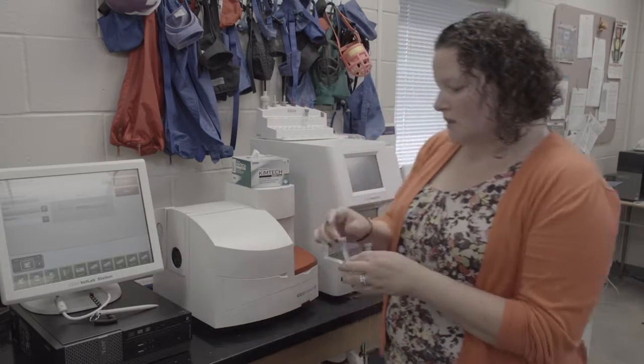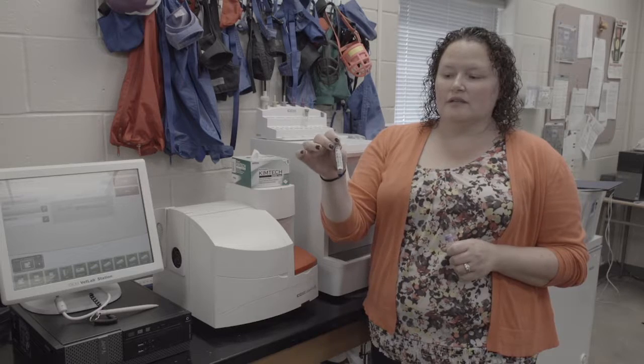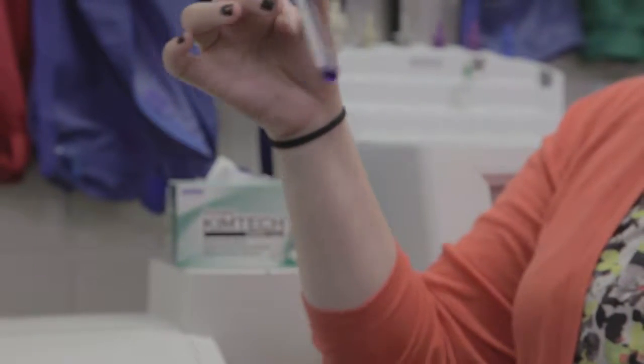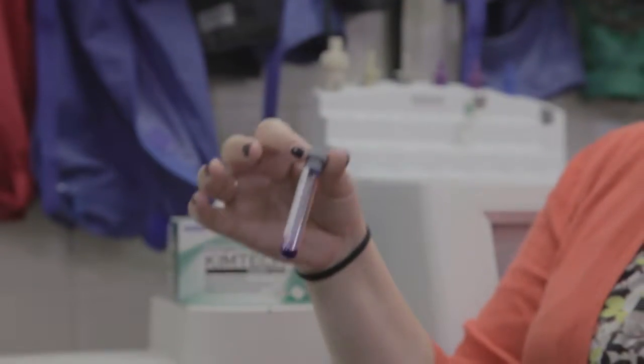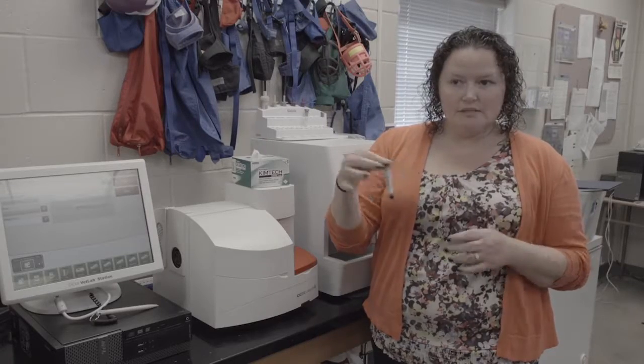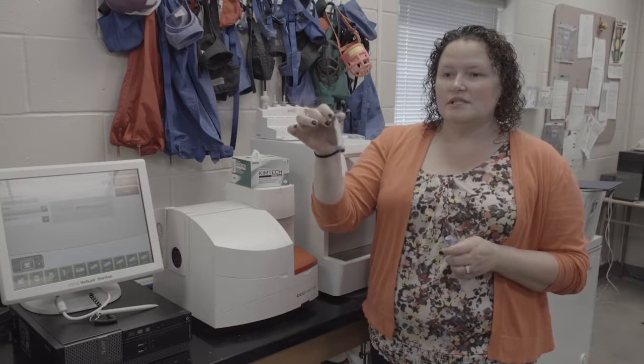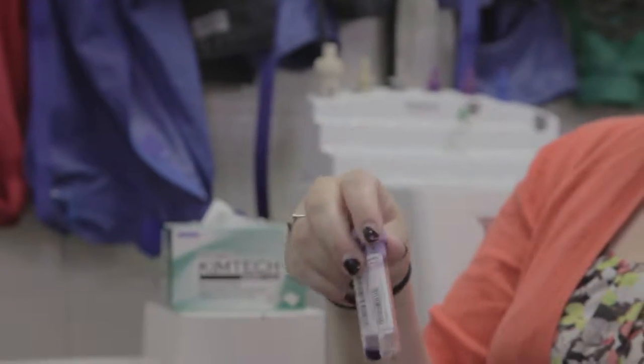Okay. The other tube that you need to run this analyzer is what we call the CBC5R tube, or the gray top tube. This tube contains what we call quali beads, which is something that the analyzer uses to judge the cells against, but then it also contains all of your reticulocyte stain. So this needs to be with the purple top tube when they go into the analyzer.